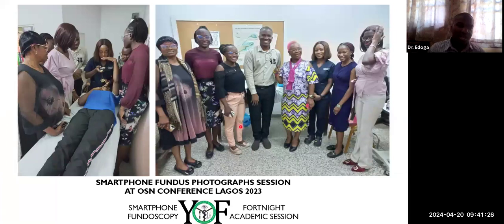So if you look on this side, you will see that the patient is lying down, and the doctor examining the patient is at the head. I found that by this positioning, you get an image that is not inverted. So what you see is actually similar to what you do in direct ophthalmoscopy. If you are looking at the right eye and you take the image, the macula will be to the left of the optic disc. The optic disc will be on the right. Same thing with the left.